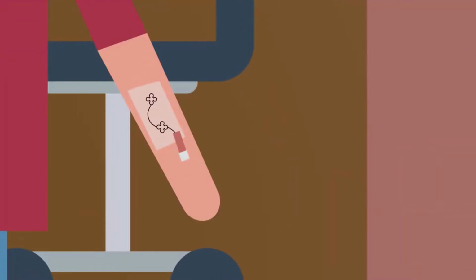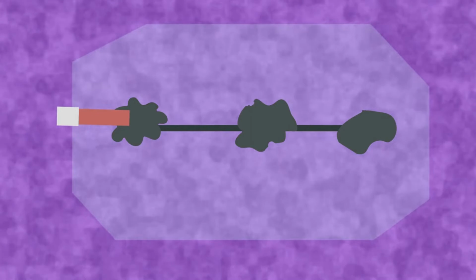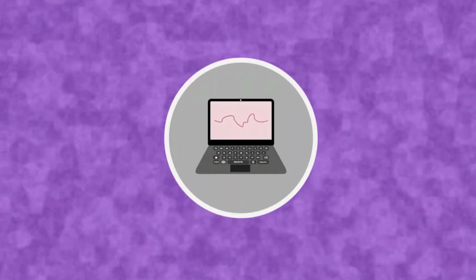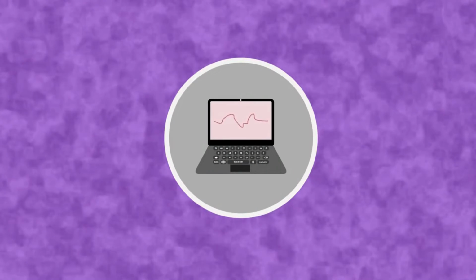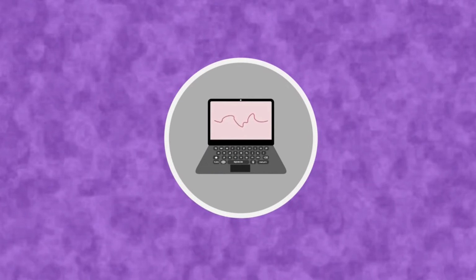Well, the future of EMG is going to be on your arm. No, seriously. Right now the main focus in EMG is to create ultra-thin and portable sensors so that patients can monitor themselves anytime, anywhere. For example, at UT Austin, using carbon conductive tape laser cut into a specific design and Tegaderm patches, researchers have managed to develop a wearable and water-resistant EMG sensor. This ultra-thin EMG sensor can remain on the skin for up to a week and can be connected to a computer where LabVIEW is used to record and store the EMG data, which can then be decomposed and processed in MATLAB to detect the frequency change in muscle contraction over time.